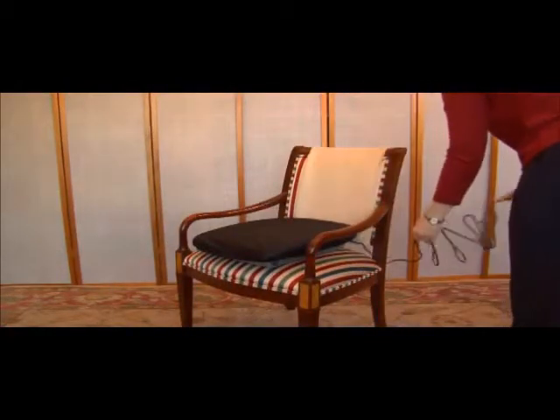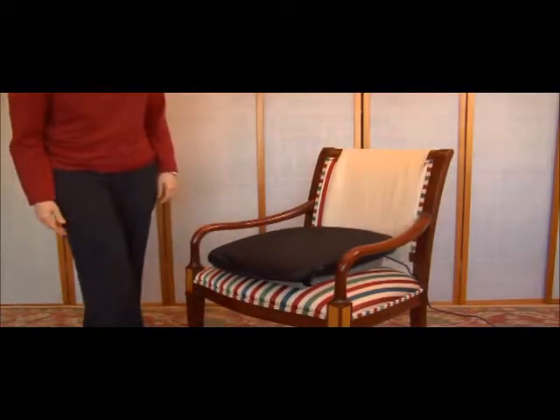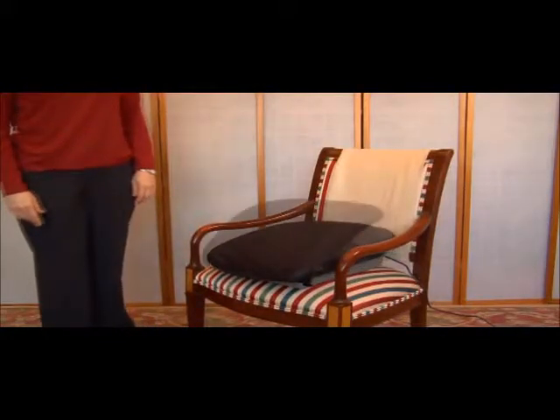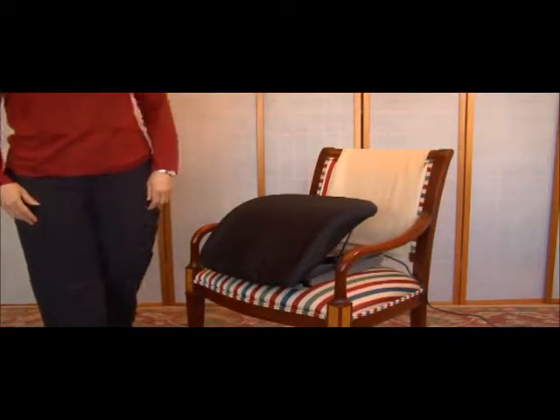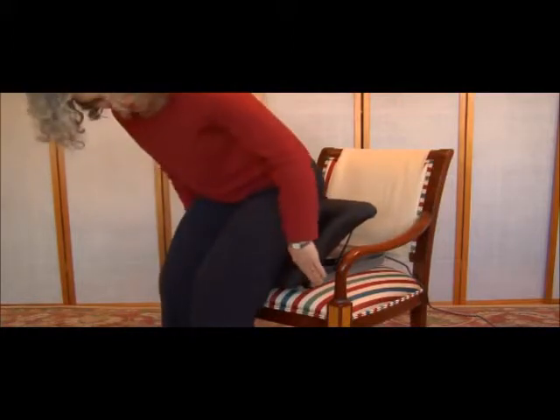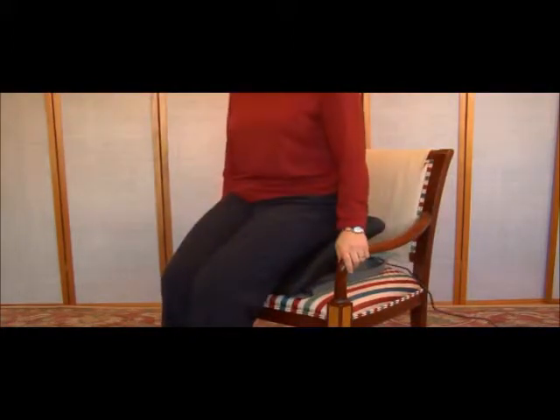Place the PowerSeat on a stable armchair or sofa. The back of the cushion should not be touching the back of the chair or it will interfere with its ability to go up and down. Next, move so that the backs of your legs touch the PowerSeat. Push the power lever down and place both hands firmly on the armrests of your chair as the PowerSeat goes down.